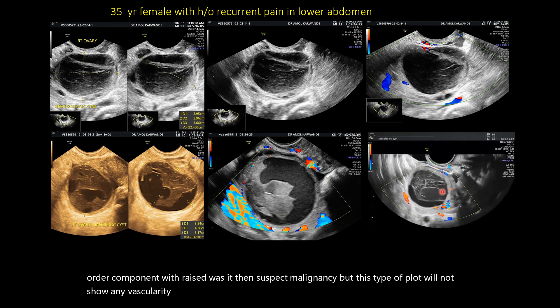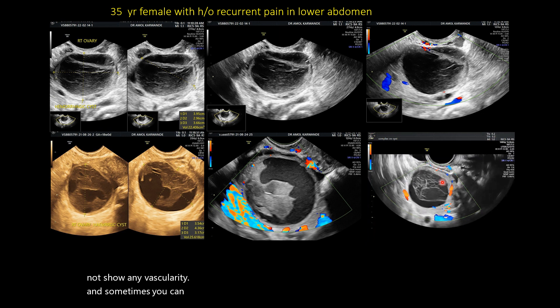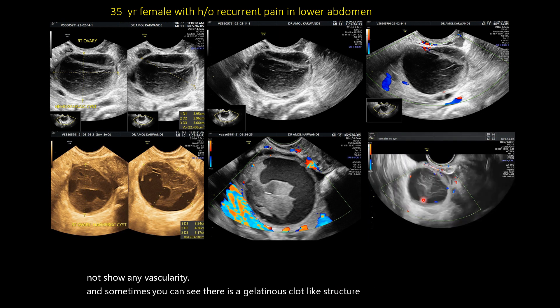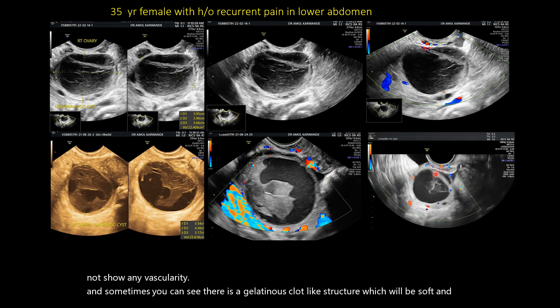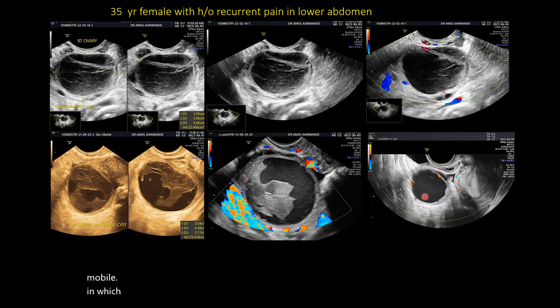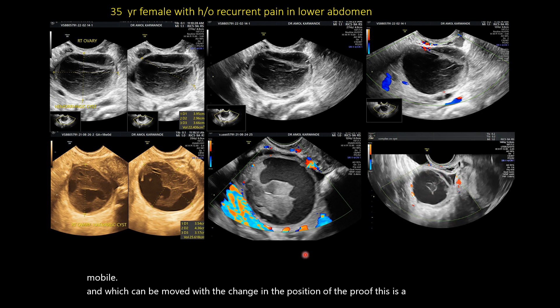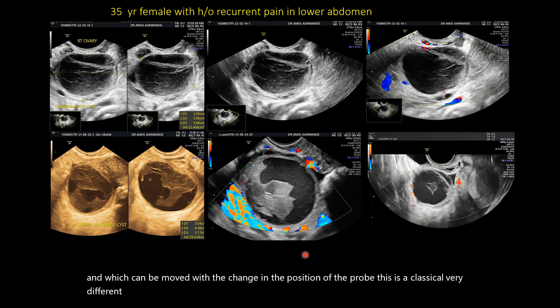Sometimes you can see there is a gelatinous clot-like structure which will be soft and mobile, and which can be moved with the change in position of the probe. This is the classical varied appearance of the hemorrhagic cyst.